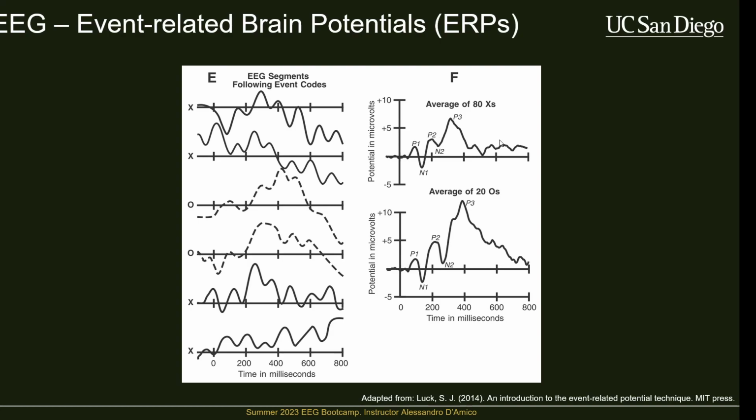But then also, how is it manipulated? What are the factors that make it present versus not present, or make it delayed versus early versus at the time that you expected? So it's this larger set of characteristics and how they're manipulated that really make a component stand out.